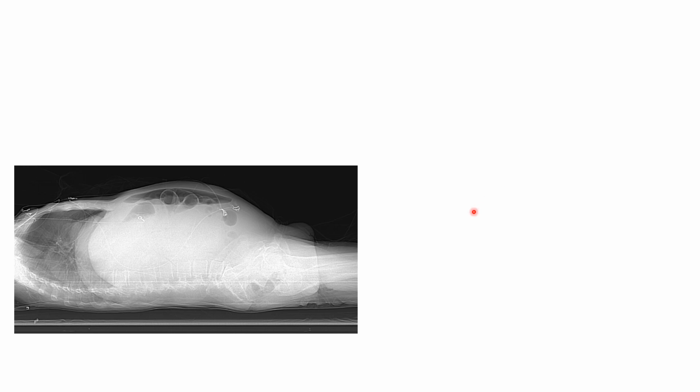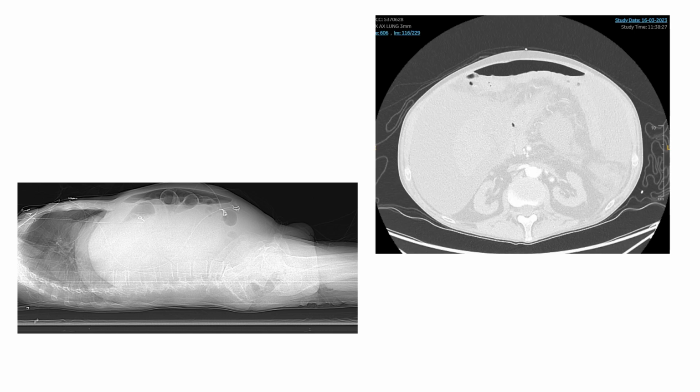We rushed with our patient to CT, where we immediately saw a lot of free intraperitoneal air. And it shows us very clearly where we should put our ultrasound probe. The best point is as anterior as possible, because this is where the air will be in a supine patient. You can also put a patient in a left lateral position and have a look at the liver for the detection of intraperitoneal free air.